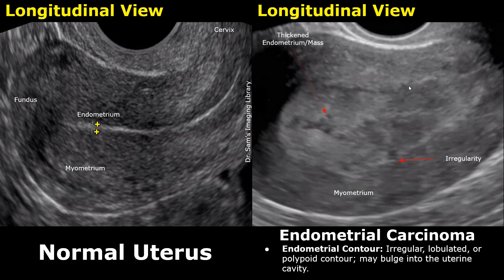This irregularity strongly indicates a malignancy and biopsy is very important to rule it out. Still, it is not always carcinoma, as in a few cases this can also be seen in endometrial hyperplasia, though it is less common — that is why biopsy is done to confirm the disease.